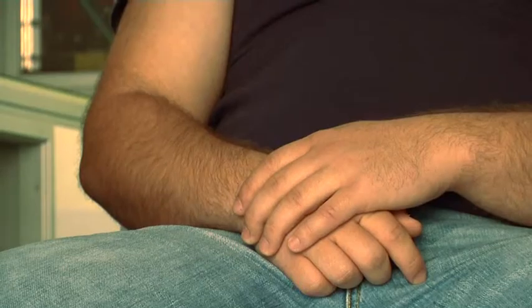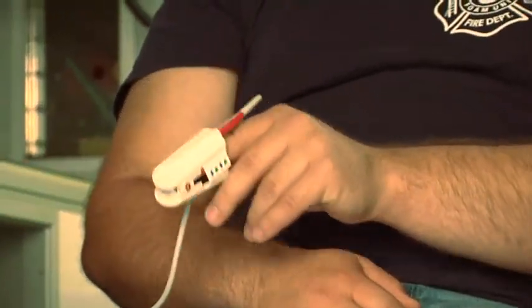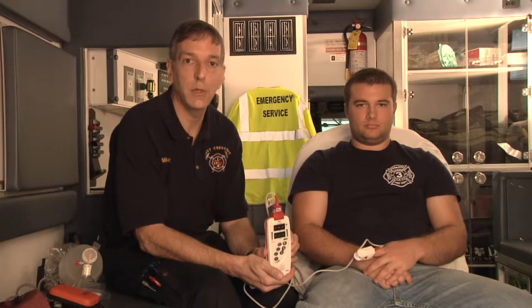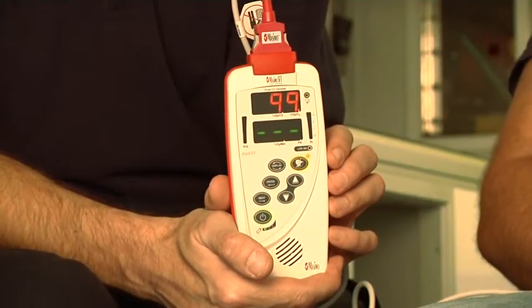We'll place a pulse oximeter on the patient's finger and pay attention to the saturation continuously during care to observe for a drop below 94%. If it drops below 94%, we either have a problem with oxygenation or perhaps a problem with ventilation.